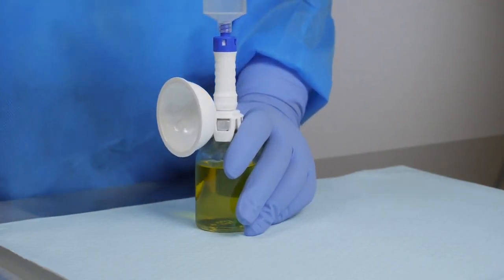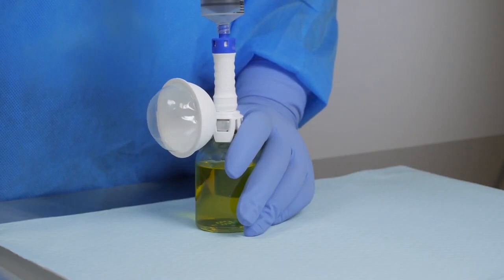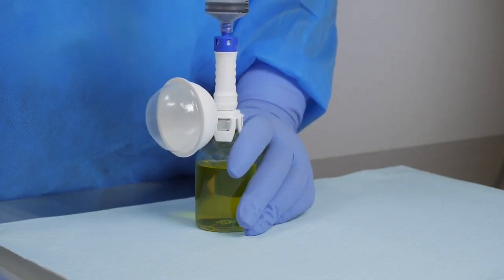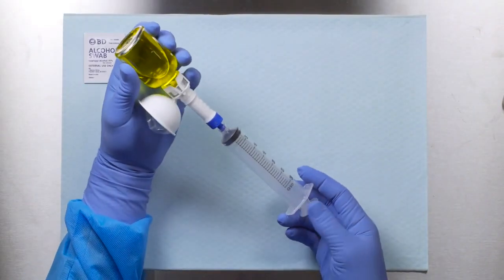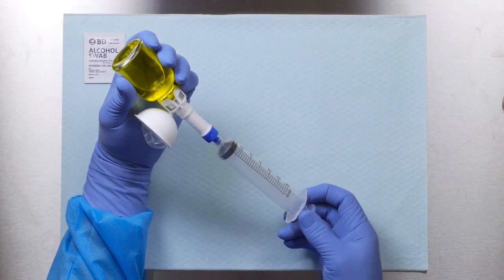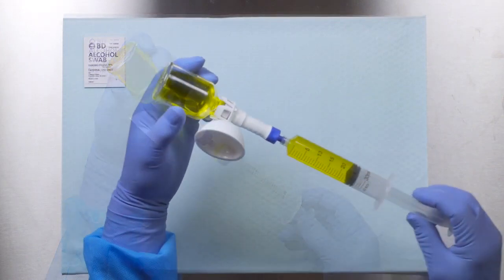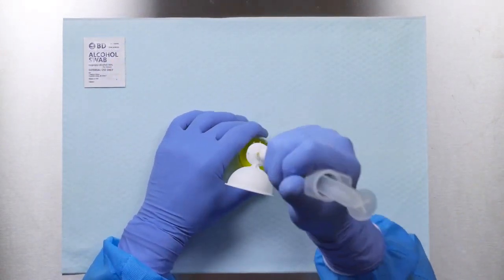Slide the injector straight onto the connection interface until the two pieces snap together. Keeping the vial upright, push the air into the vial. The expansion chamber will inflate. Invert the system and withdraw the drug into the syringe. The expansion chamber will deflate. Pull the injector straight back until the two pieces are disconnected.